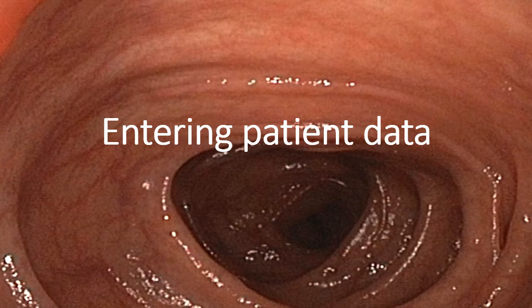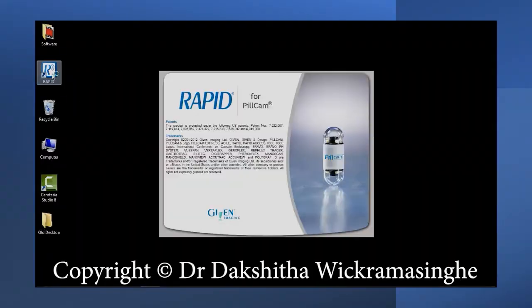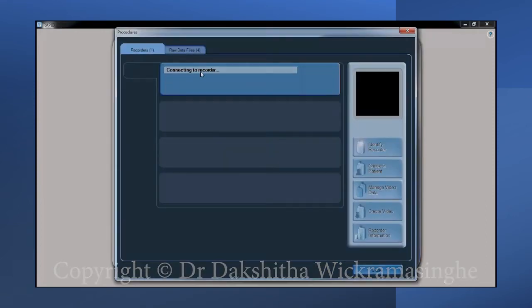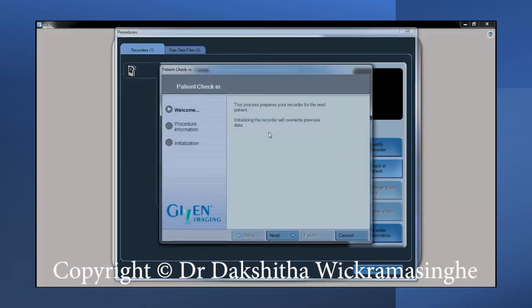You need to enter the patient data before commencing the procedure. Load the software by clicking the RAPID icon. Click on the patient check-in button. The software will indicate that it is trying to connect to the recorder. Select the recorder and press the check-in patient button.